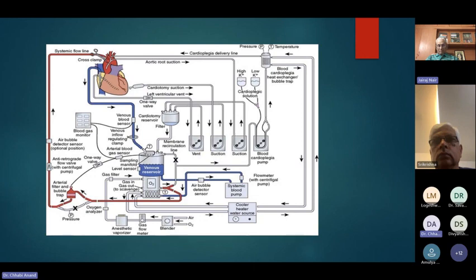This is the CPB circuit. It shows the arrangement of a typical cardiopulmonary bypass circuit using a membrane oxygenator with integral hard shell venous reservoir, which is at the lower center, and systemic heat exchanger and external cardiotomy reservoir. Venous cannulation is by cavoatrial cannula and arterial cannulation is in the ascending aorta. The systemic blood pump may be either roller or centrifugal type. The cardioplegia delivery system on the right side is a one-pass combination blood crystalloid type.